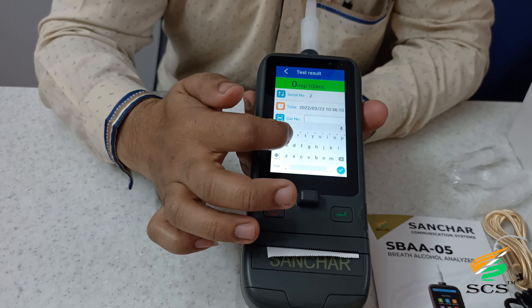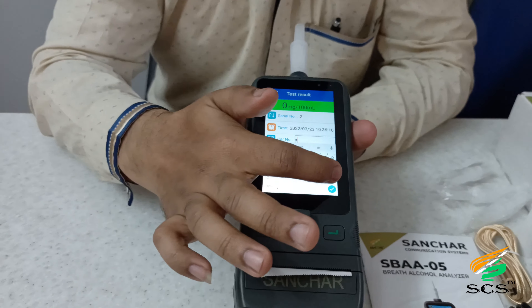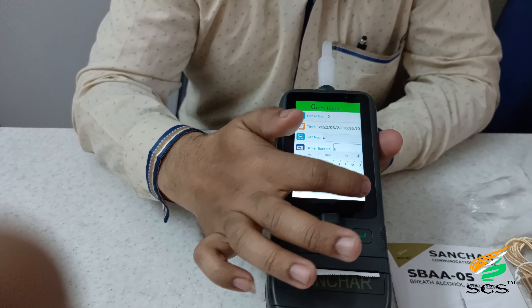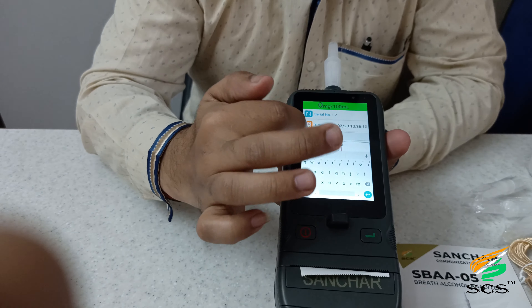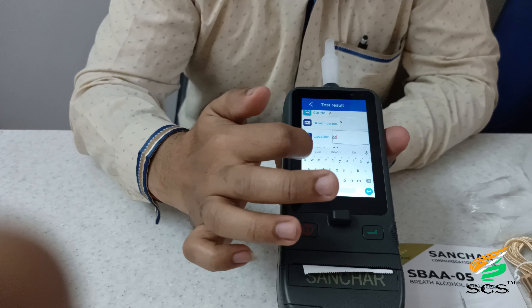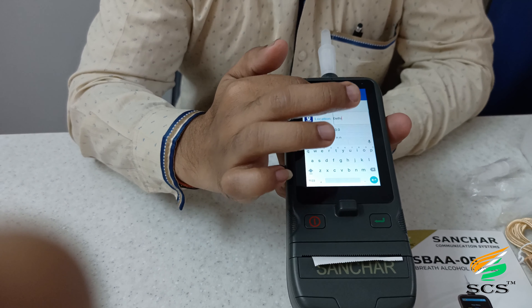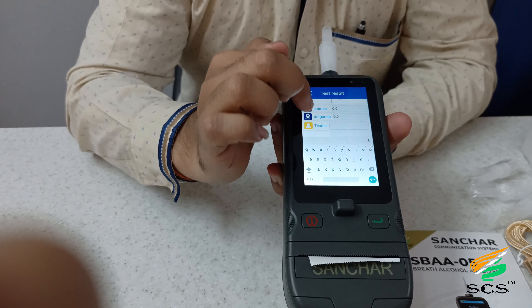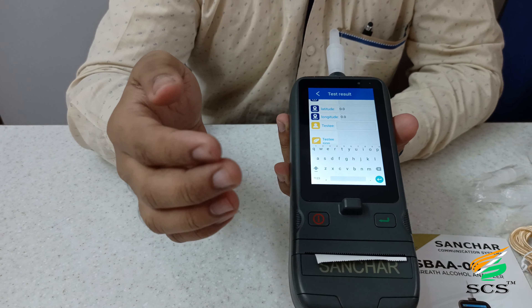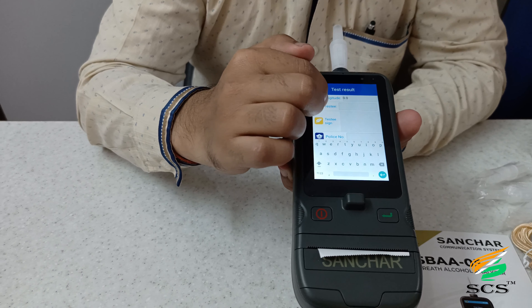You can see the serial number, date, and time details. There are other parameters to fill in: car number — for example, we entered a value and click right to confirm. Then driver license — enter a value and click right to confirm. This is the location field; the user can put any location, for example we put Delhi. Click right to confirm. Latitude and longitude are also shown — make sure your device is outside so it will detect your accurate GPS location.